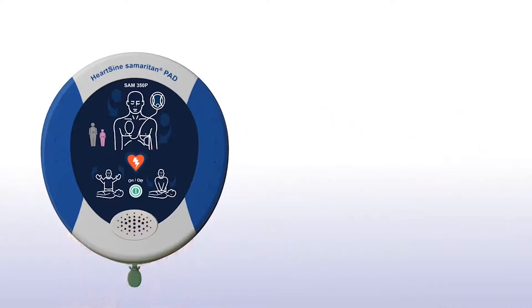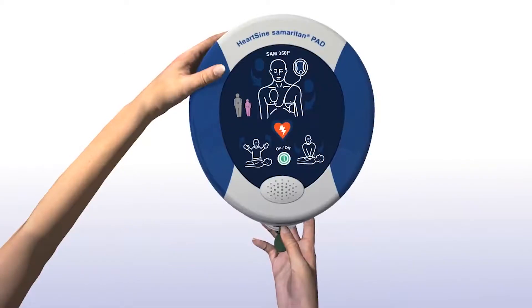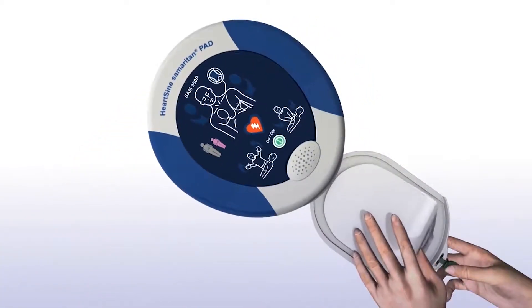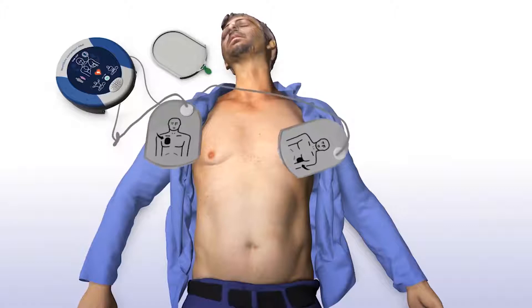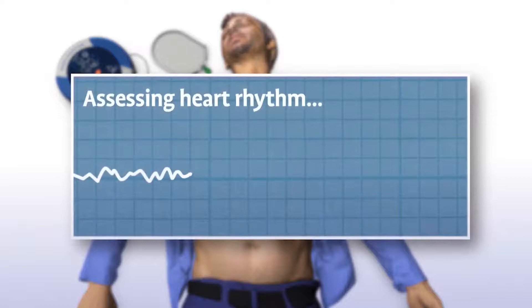Adult patient. Call for medical assistance. Remove clothing from the patient's chest to expose bare skin. Pull the green tab to remove pads, then peel pads from the liner. Apply pads to the patient's bare chest as shown in the picture, and press pads firmly to the patient's bare skin.